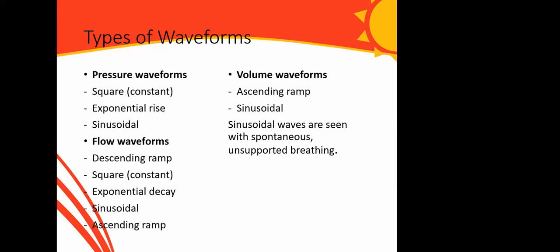Don't forget that sinusoidal waveforms are particularly seen in unsupported breathing. So when you see a sinusoidal waveform, you need to know that this patient is having unsupported spontaneous breathing.